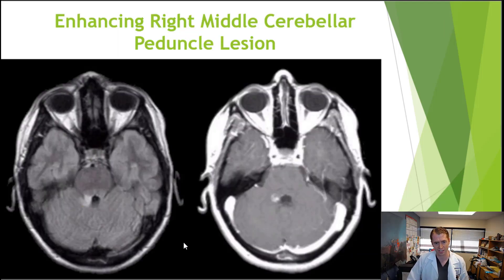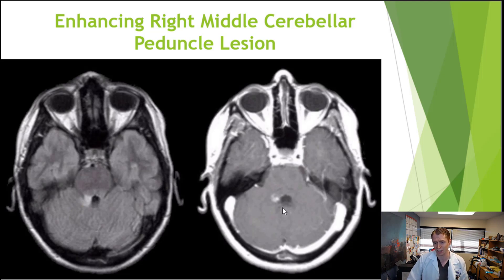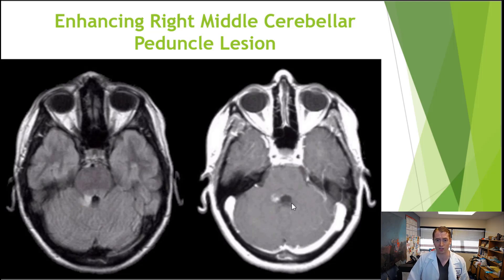Here's another example on a different MRI. You can see this enhancing lesion in the right posterior middle cerebellar peduncle. This could cause symptoms such as tremor, dizziness, or if it involves the sixth cranial nerve nucleus, you could get double vision when looking to the right side.